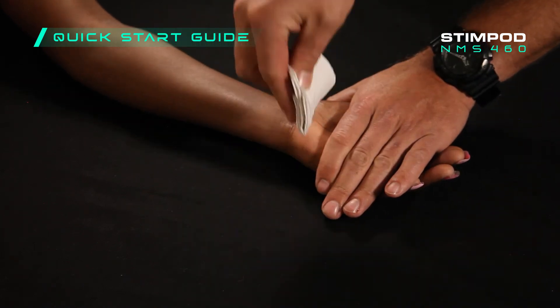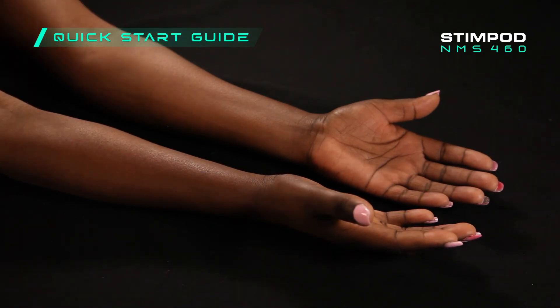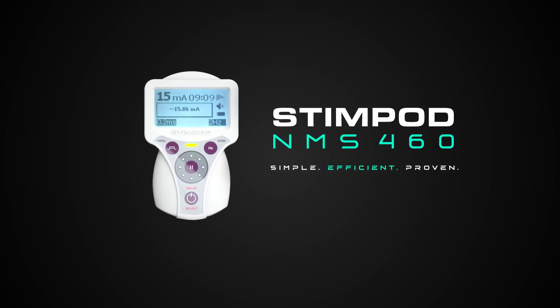Once you have completed the treatment, wipe the treatment area clean of any remaining conductive gel. You may also detach the clip and remove the reference electrode. For any more information on how to most effectively use the StimPod, visit algamed.com. StimPod — simple, efficient, and proven success with chronic and neuropathic pain treatment.